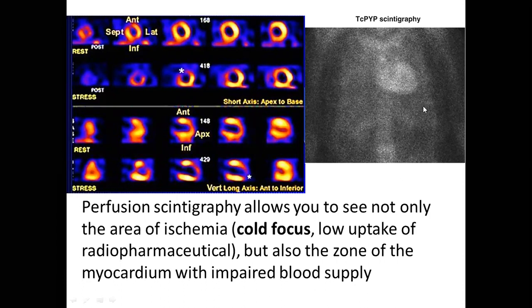Scintigraphy, first of all, is a technique where we understand how tissues are vascularized with a radiopharmaceutical. A radiopharmaceutical is a compound which consists of a radioactive element and some transport ligand. Depending on this ligand, we may have different sensitivity and different affinity of some tissues to specific radiopharmaceuticals. However, the heart is not that specific, so it will light up every time we use scintigraphy.